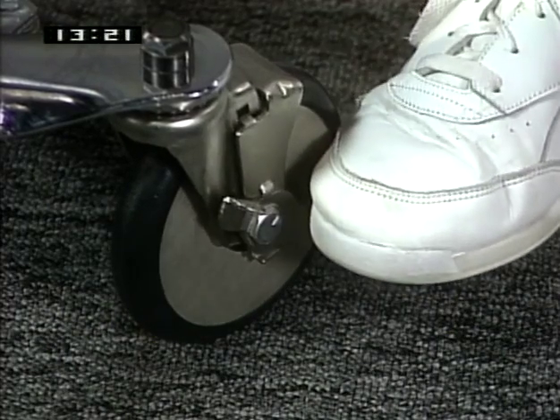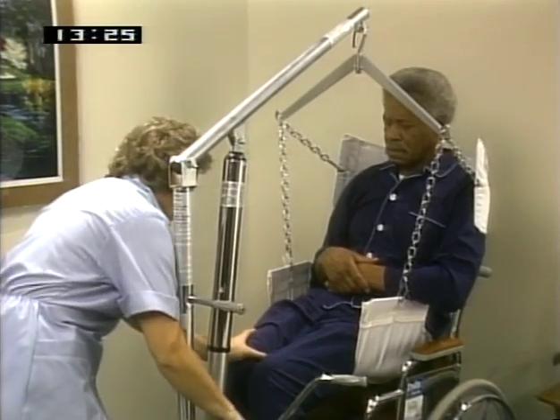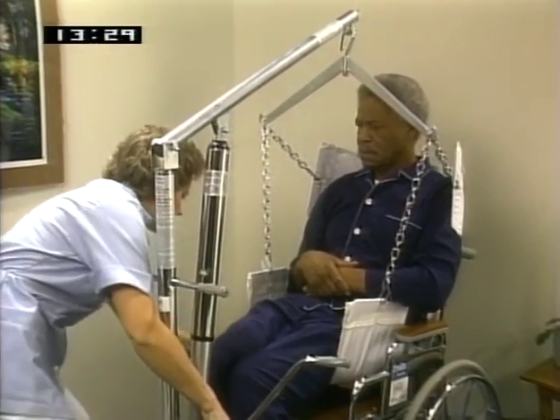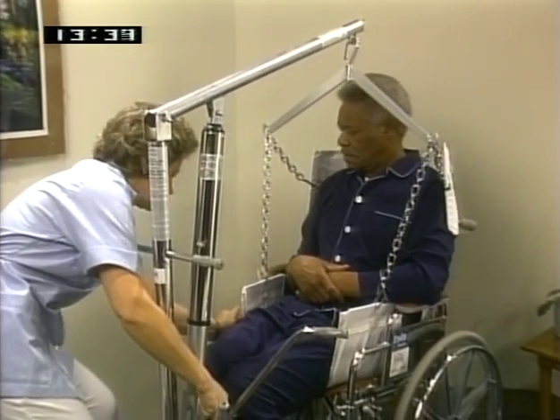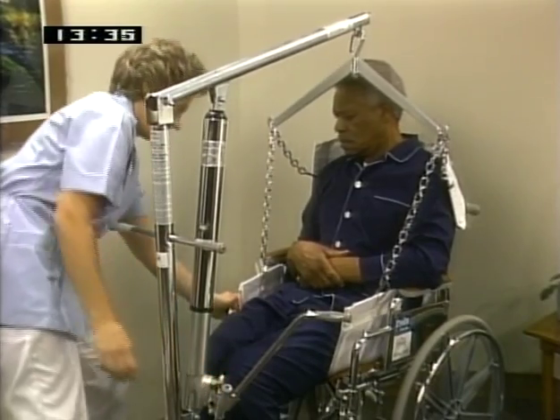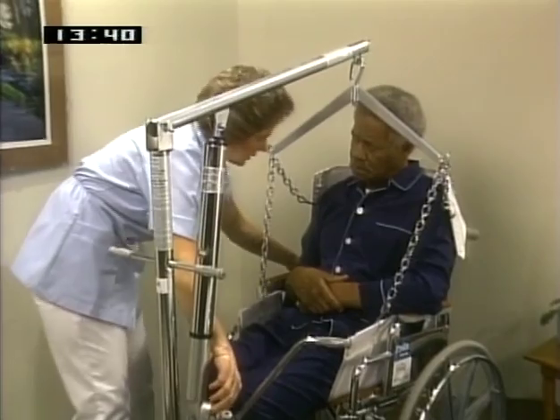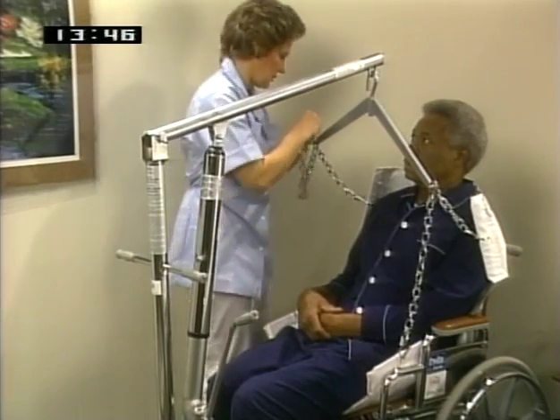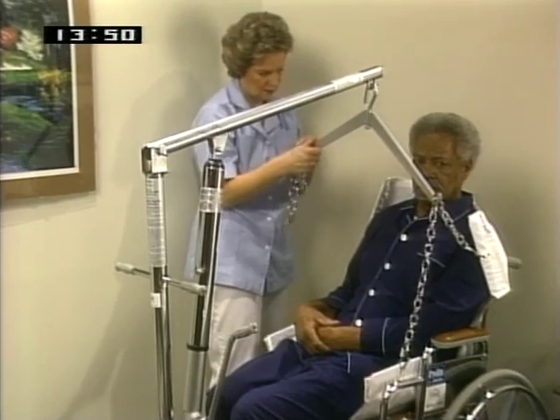Lock the caster brakes. To lower the patient into the chair, open the hydraulic release knob by turning it counterclockwise, no more than one full turn. Use one hand to open the knob, the other to ensure that the patient's position is correct as you guide his descent. After the patient reaches the seat, push down on the boom to slacken the chains. Detach the S-hooks to remove the chains from the sling. The patient can remain sitting on the sling.